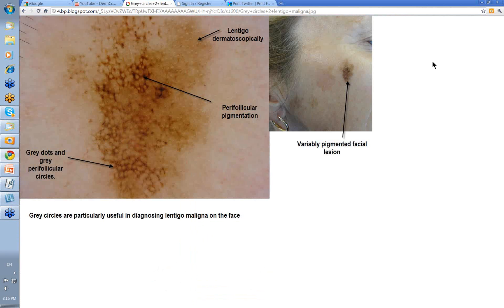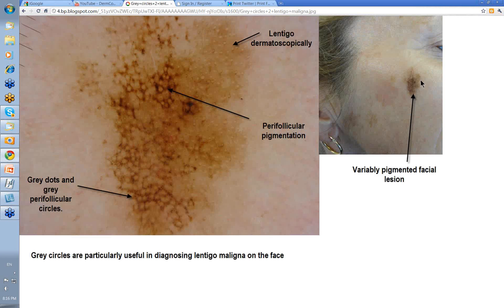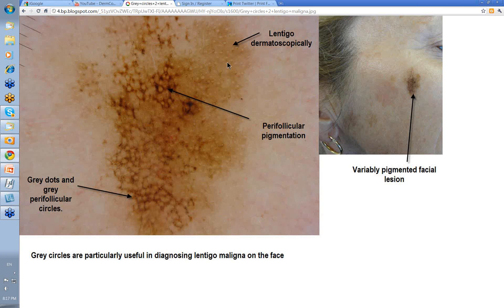This one clinically is a lot more obvious. You'll see a darker area of pigmentation and a lighter area, so a variably pigmented facial lesion. You stick your dermatoscope on it — you see the perifollicular pigmentation, gray dots, perifollicular circles. This area up here has follicular openings in a very uniform brown color, which is a simple lentigo dermoscopically. But these other areas are lentigo maligna.